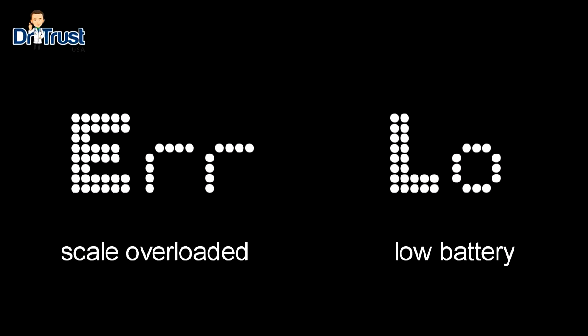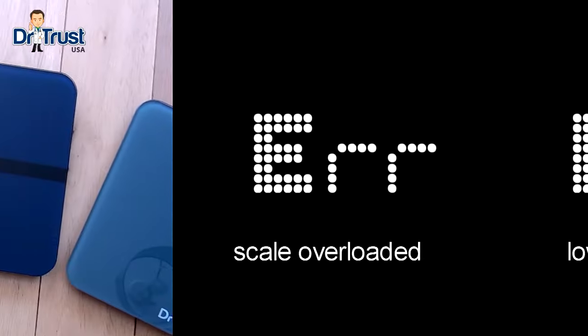If there has been an error in the reading or the scale has been overloaded, the display will show ERR. And if the scale needs charging, it will display LO for low battery.